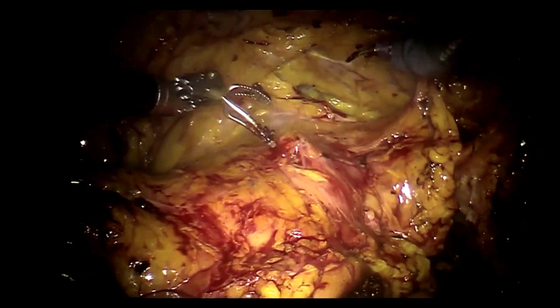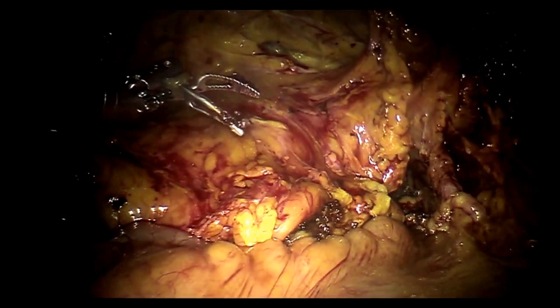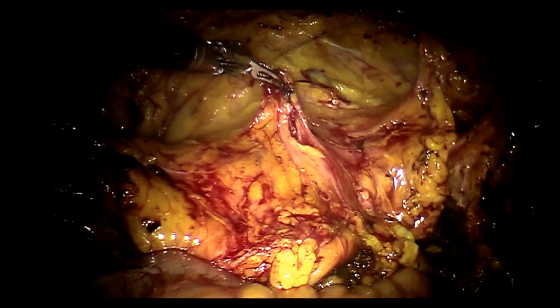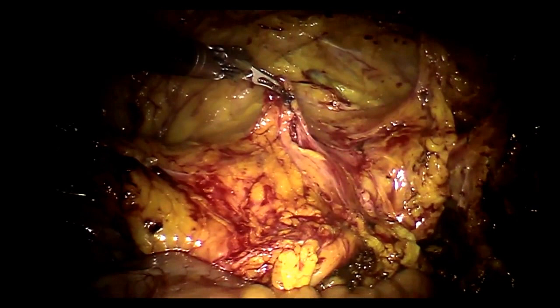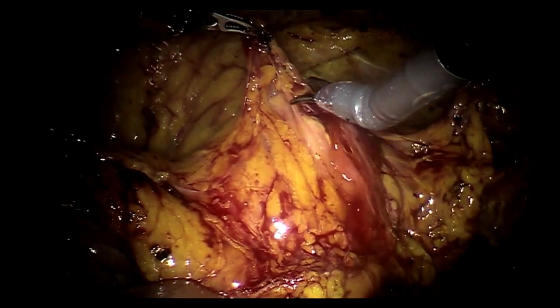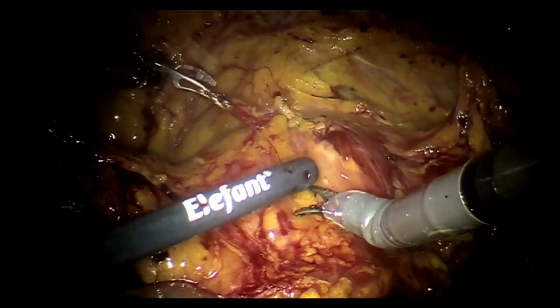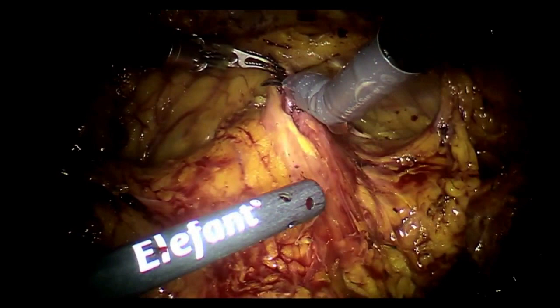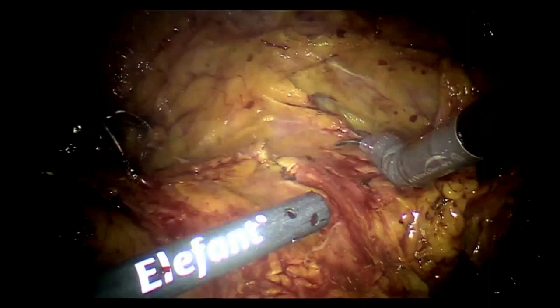Maybe we can plug the ureter there? Yeah, show me. Give me the scissors back in that case. We're thinking we may just plug the ureter in here, but that'll depend. Yeah, it's in a good location. Let's see if the ureter gets there. I swear to God, all I was doing was retracting it a little bit.